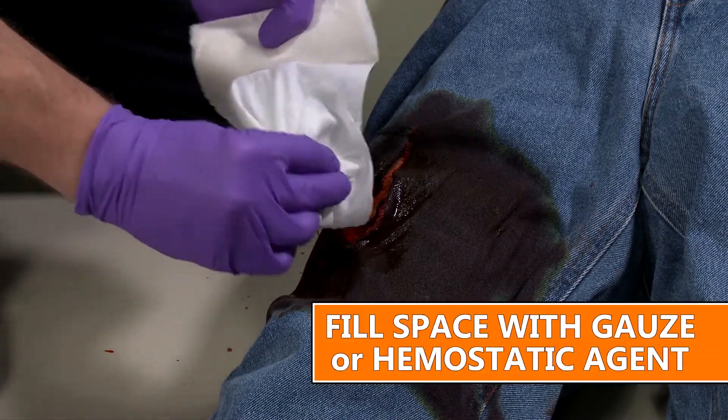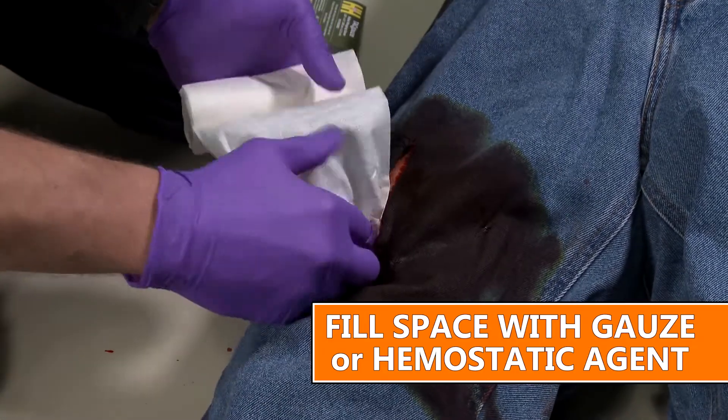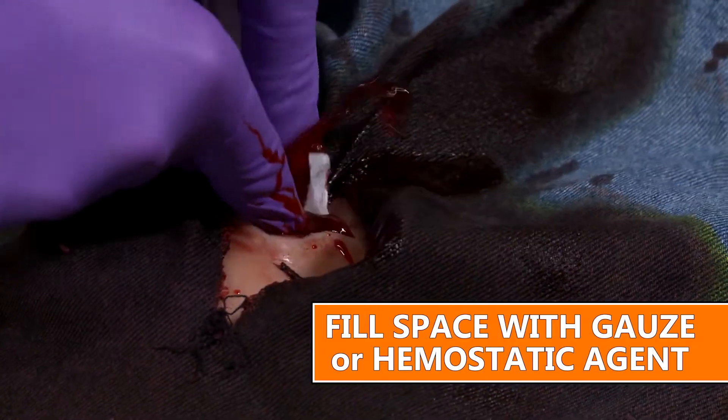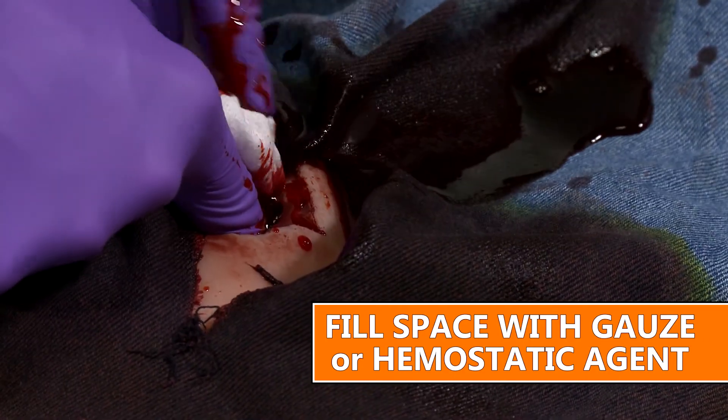Third, you'll want to fill that space over the vessel with gauze or hemostatic agent to help maintain pressure and compression of that bleeding vessel between your finger and the bone.